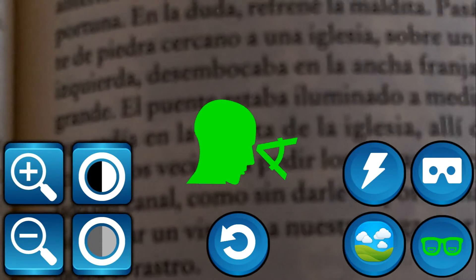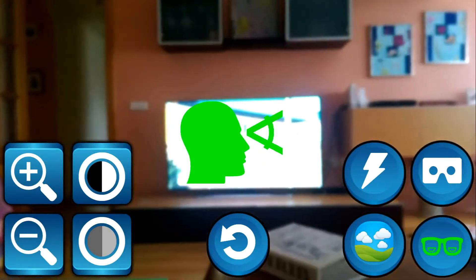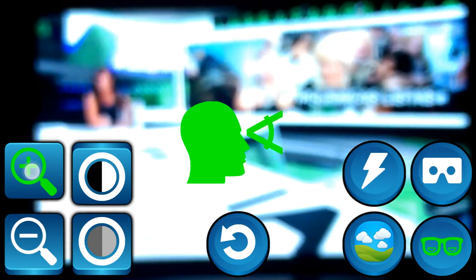This is the Bifocal mode, where you can use one setup for far view and another one for near view. The application automatically detects when you change your view and applies the desired setup in each case.